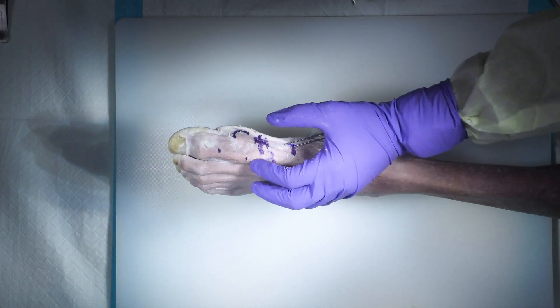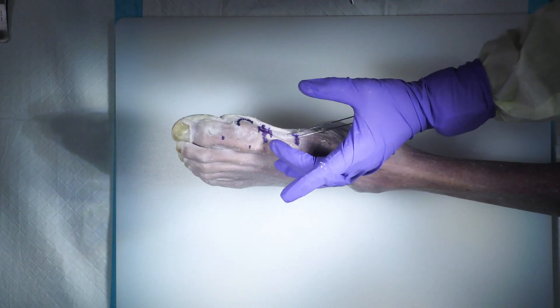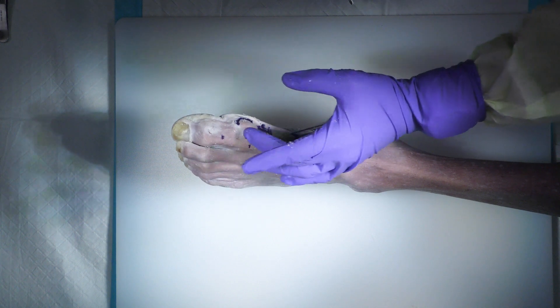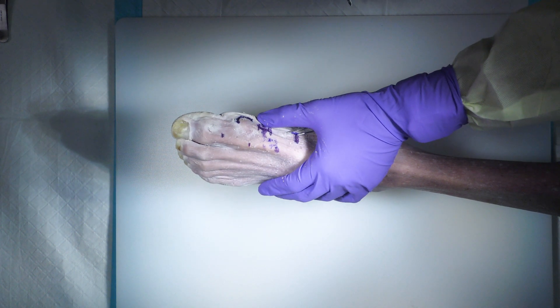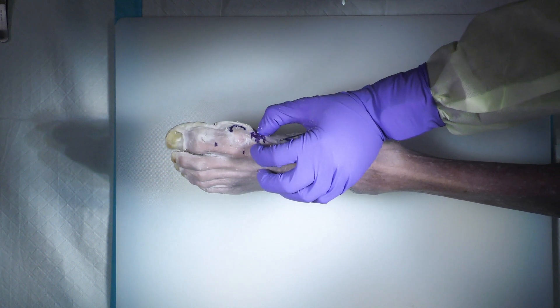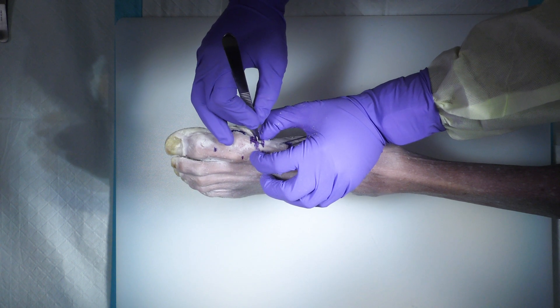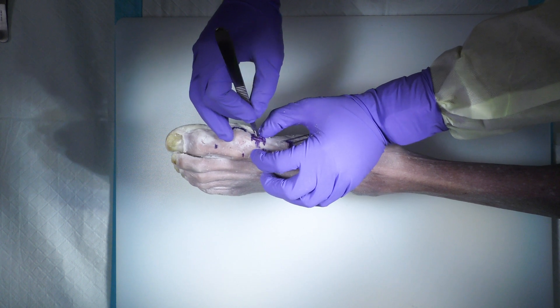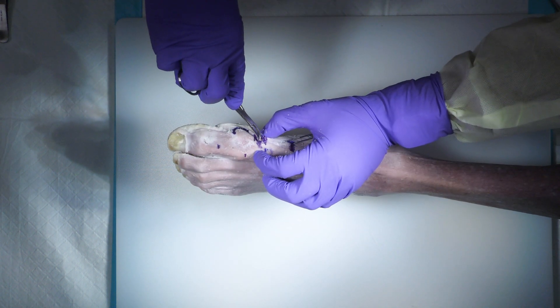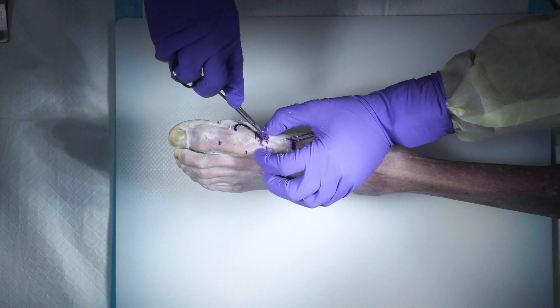You've got your tendon here, you've got your medial dorsal cutaneous nerve sitting right here on the dorsal medial aspect of this first ray, and you have a nerve plantarly. Because the incision placement is right at the metatarsal, I'll feel the top and bottom of the bone, go straight in the middle — I know I'm in a safe spot. I'll make a small incision and use a hemostat to create a clear space, ensuring I'm not going to be close to any nerve or vascular structures.